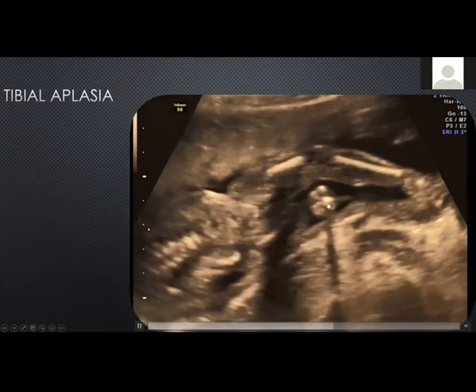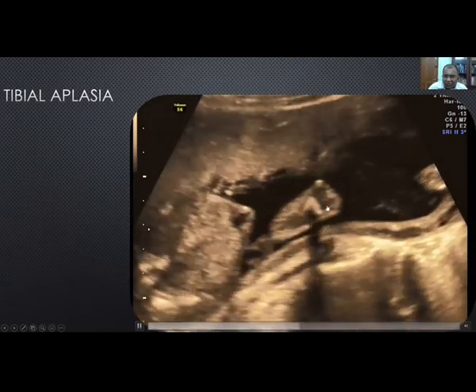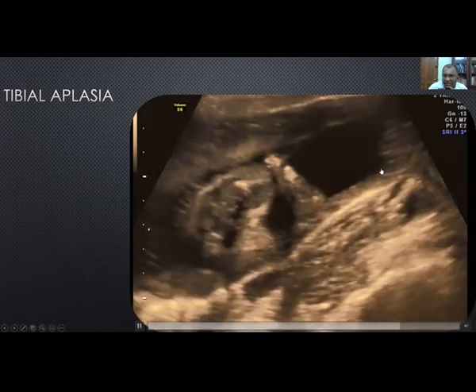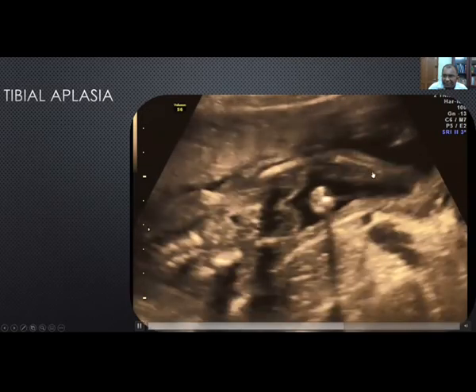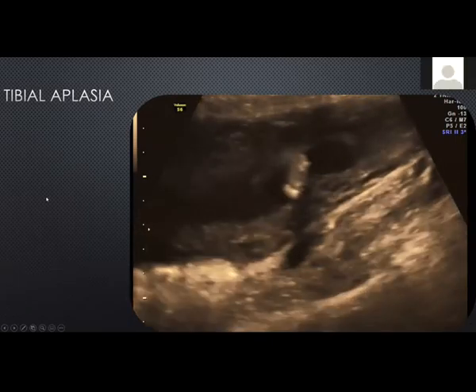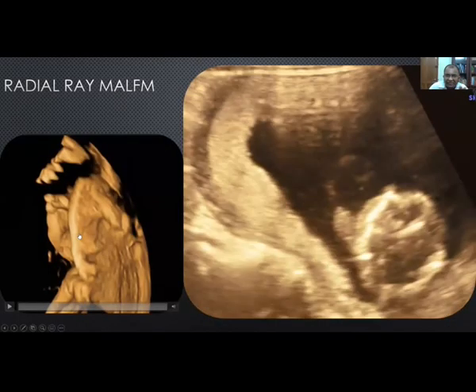This is the fibula. Here, like the other one, there is only a single line. Here, 2 bones. See the right place here. You need to look for these things.